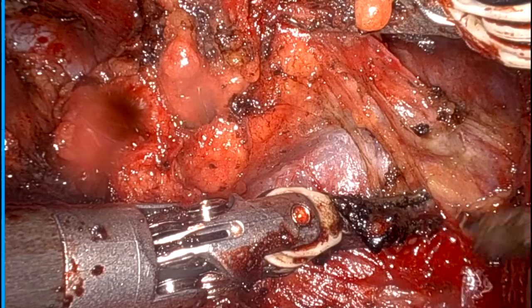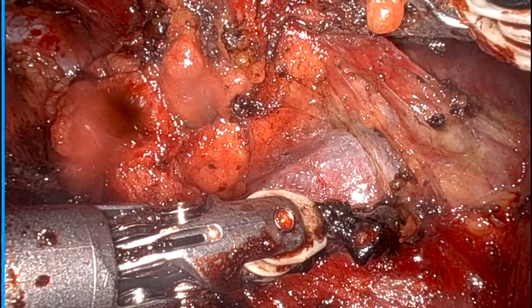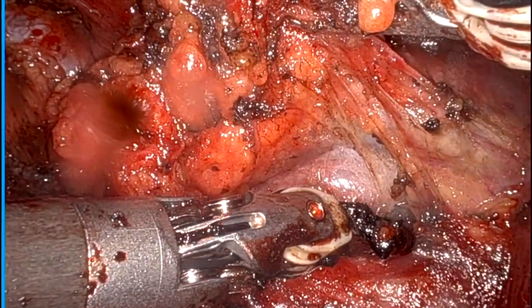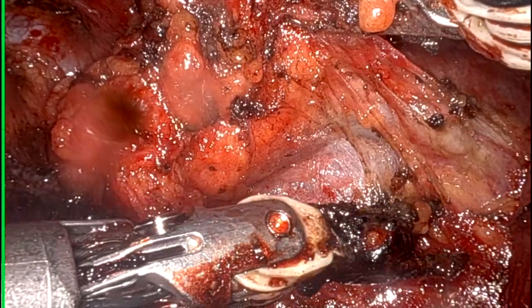All these nodes are reactive nodes, because when I am giving this voiceover, I already have the final histopath report in my hand.